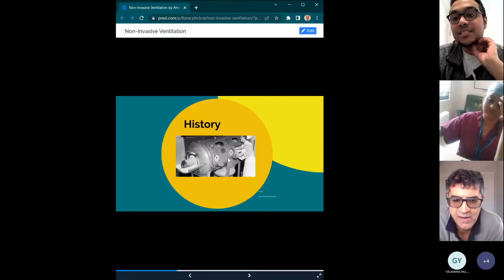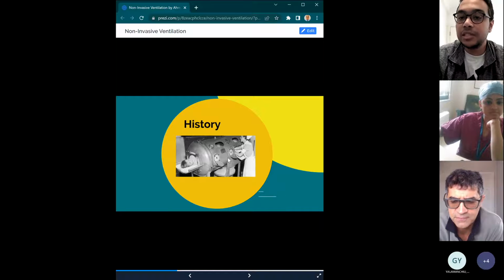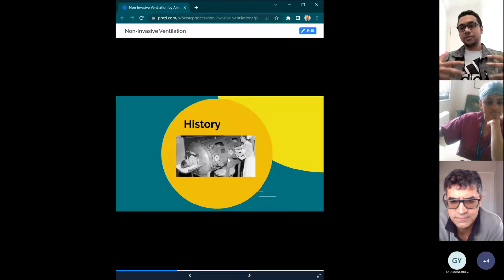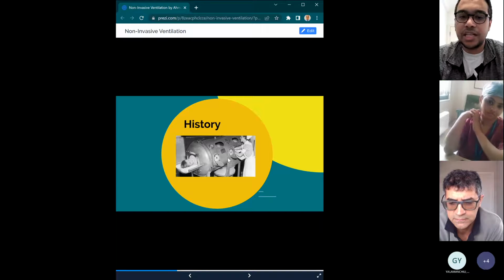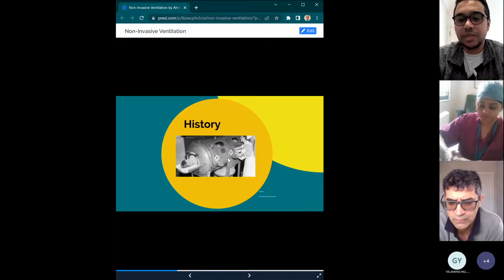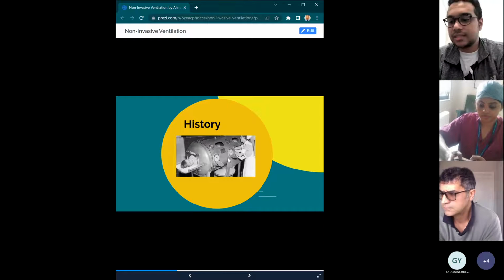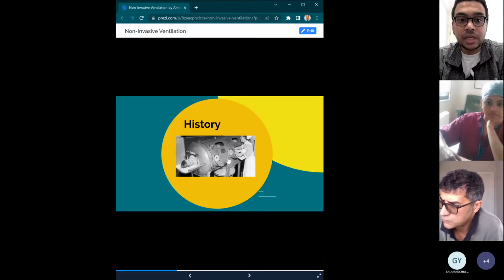The iron lung was first introduced between 1920 and 1950 during the polio epidemics that happened around the world. The main idea is to apply a negative pressure on the chest from outside, which is still there actually. It's not obsolete, but it's not around very much as the regular NIV. We mostly use it for patients with very weak chest muscles, like patients with motor neuron disease or patients with very bad COPD. So that's the first time an NIV-like idea was used.